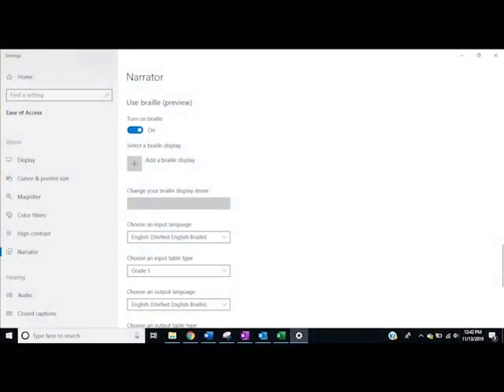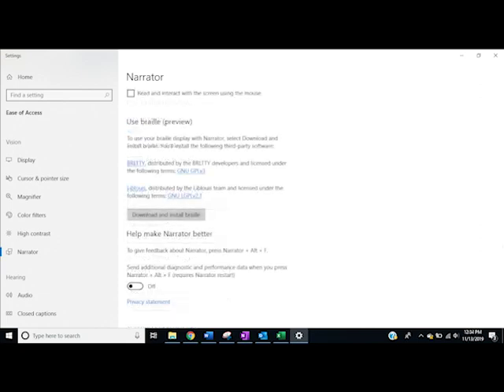First, open Narrator settings by pressing the Windows key plus Control plus N. Then navigate to the Use Braille option. Install the braille driver by clicking on the Download and Install Braille option.